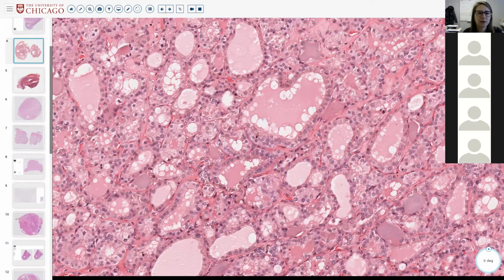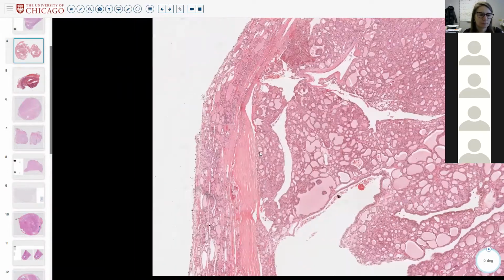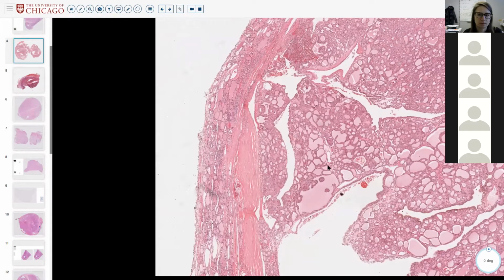Okay. So yeah, your diagnosis is? It looks like this is close, yeah, Graves' disease, but we don't call that outright on resection because that's more of a clinical diagnosis. So does Graves' disease diffusely involve the whole thyroid or not? I don't remember actually. I think it does. Is Graves' disease a tumor or a medical disease? It's a medical disease, so it involves the entire thyroid. Right. So it's a serologic problem, basically, right? So you should have diffuse involvement of the entire thyroid of whatever it is.